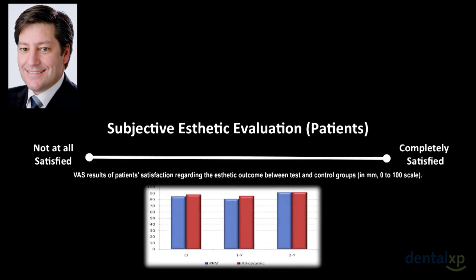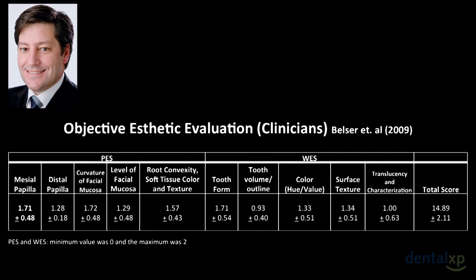I show you here, no difference. They all liked about 90% of the crowns that we gave them, and 2 years after, they were equally happy with the PFM or the all ceramic crowns.